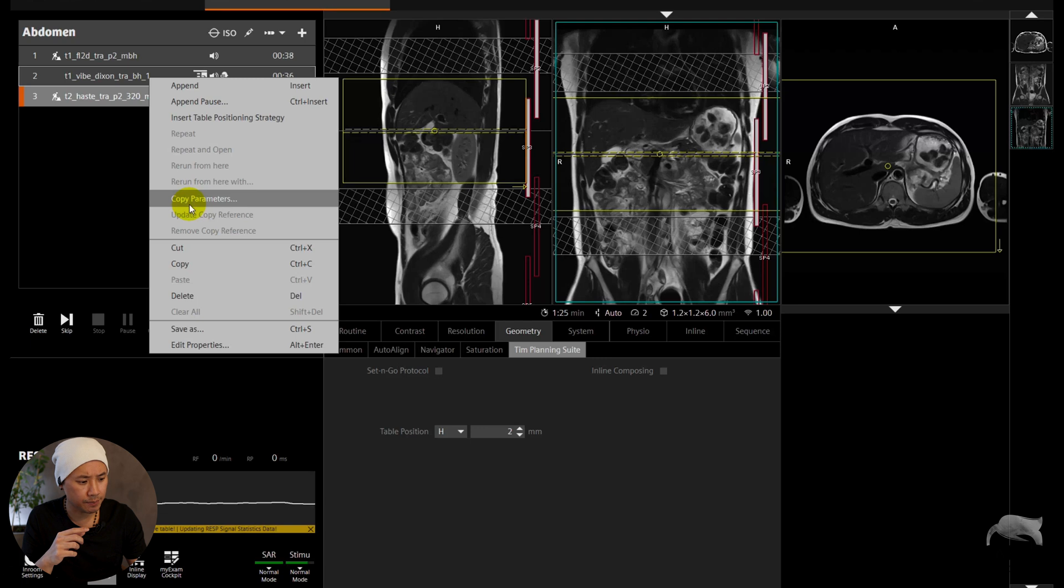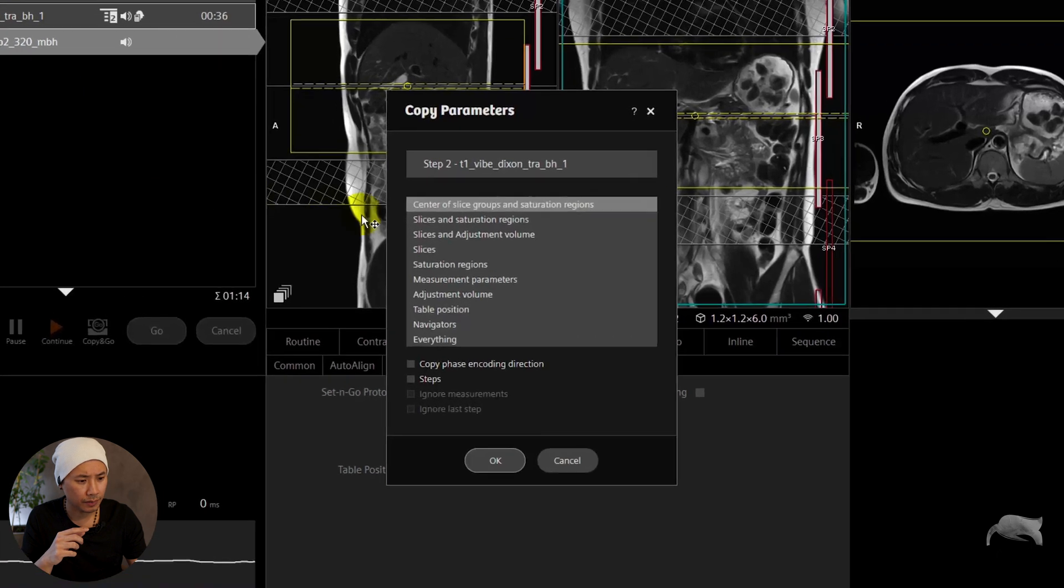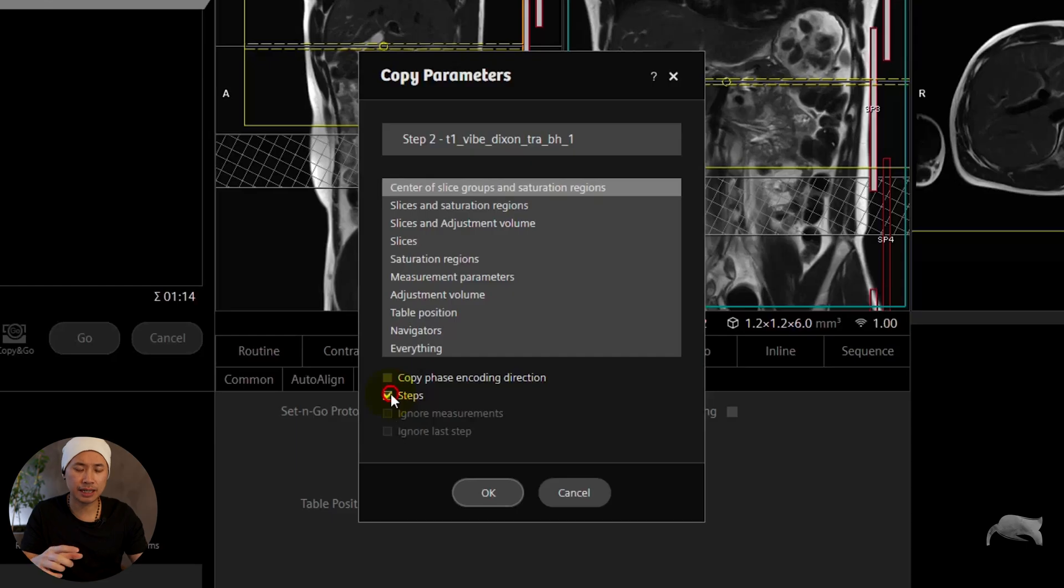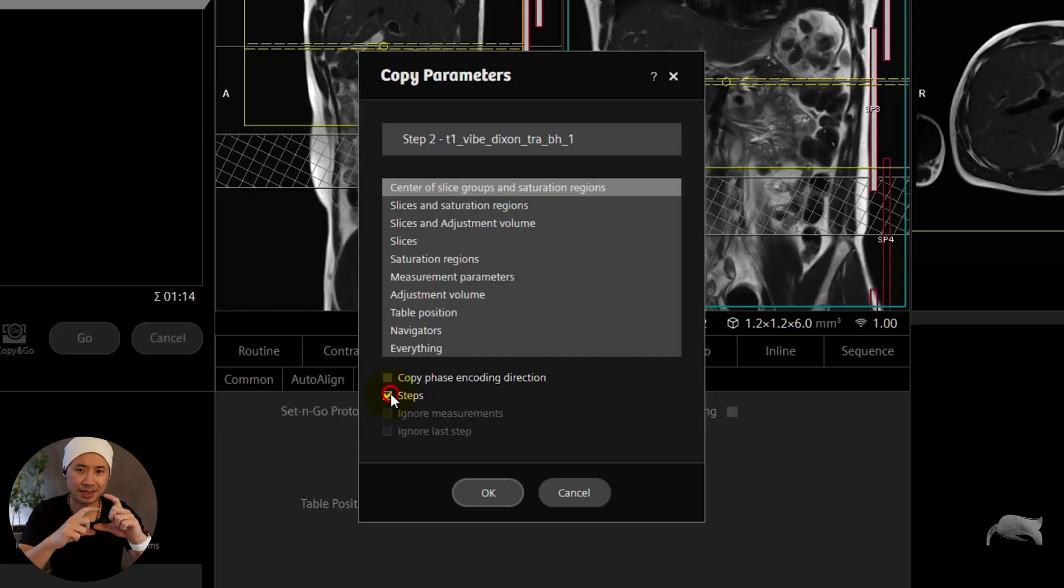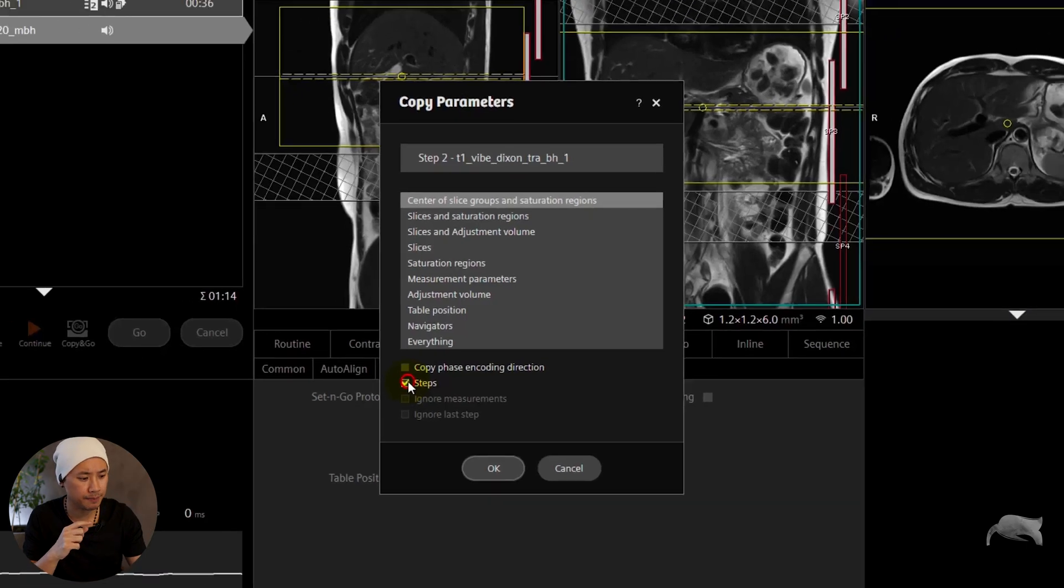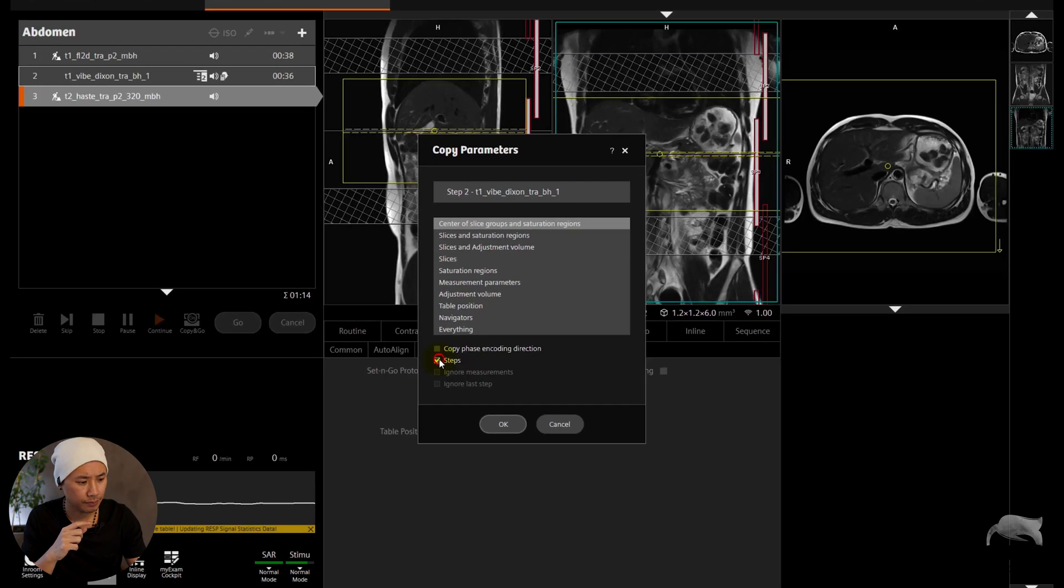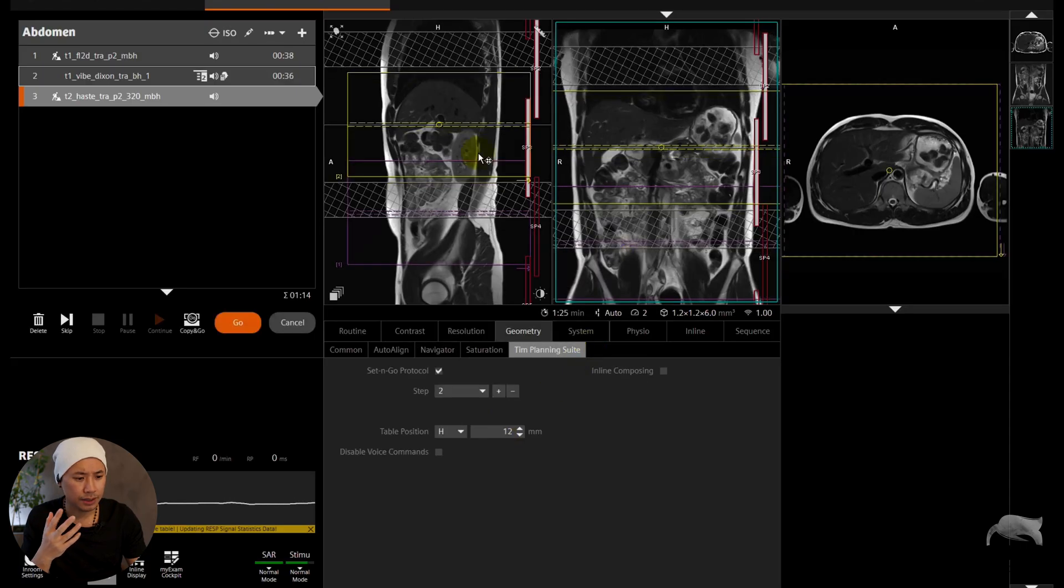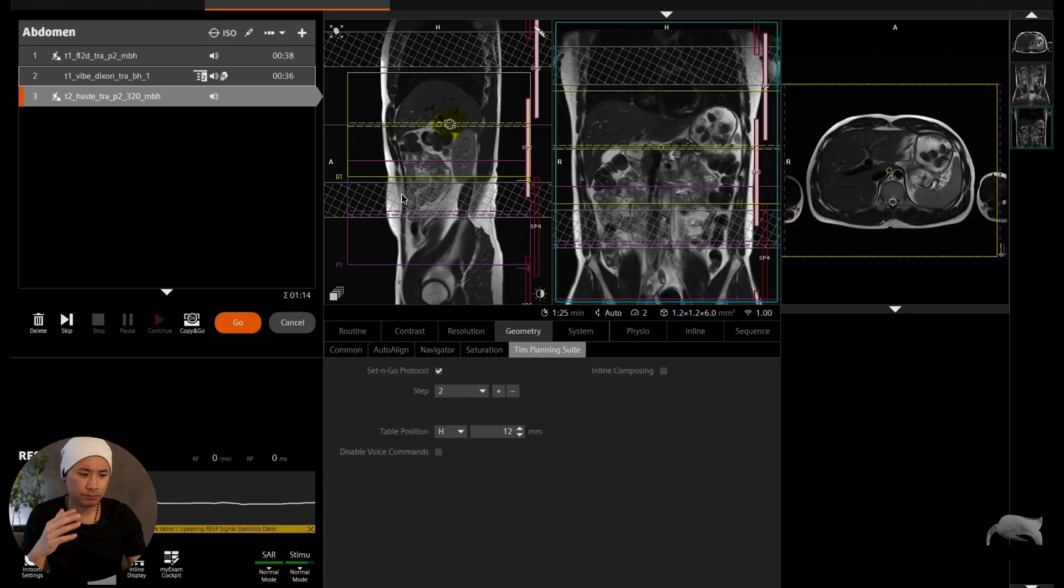As seen there, you just choose Center of Slices Group, and this is the most important part, this one, Steps. If you put Steps on, it will automatically give you two steps. Okay, like this. So the coverage is more or less the same.